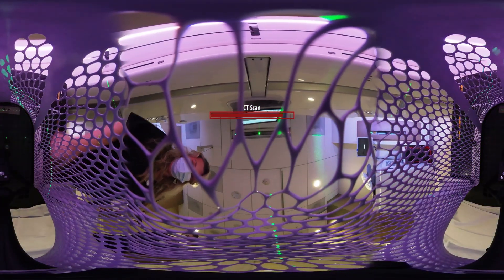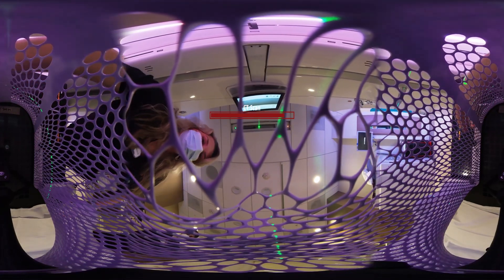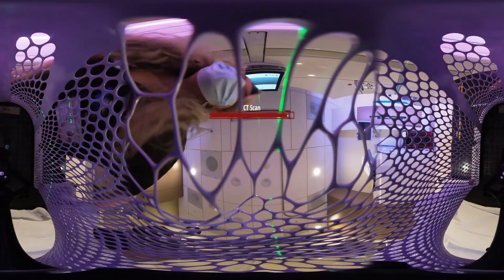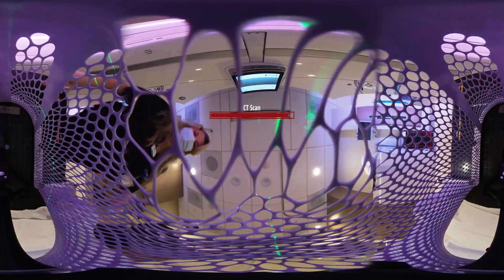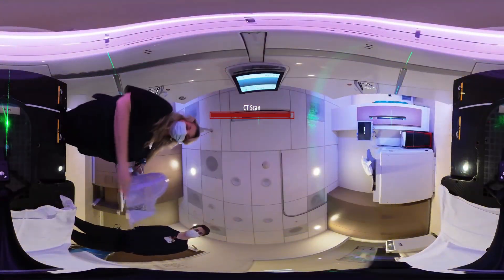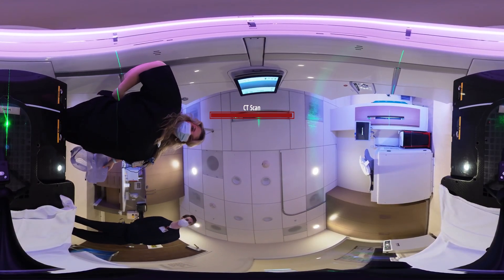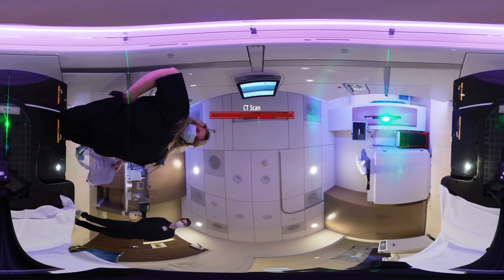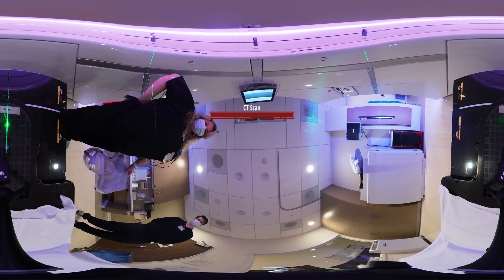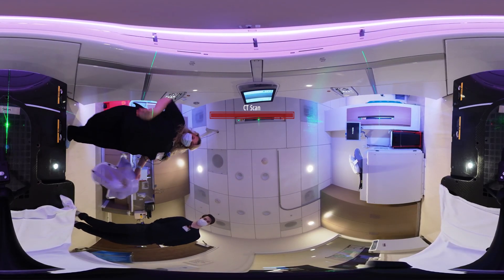You are all done. Once again, start wiggling your face. We will get this mask off. And you are free to go. Let us just lower this table. We will see you at your return visit appointment. Have a wonderful day.